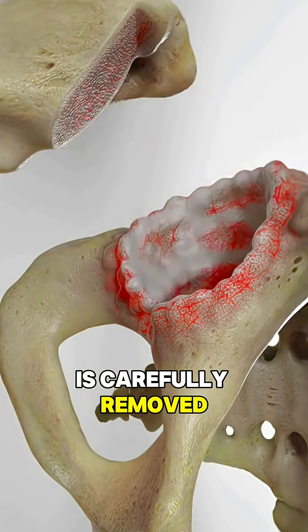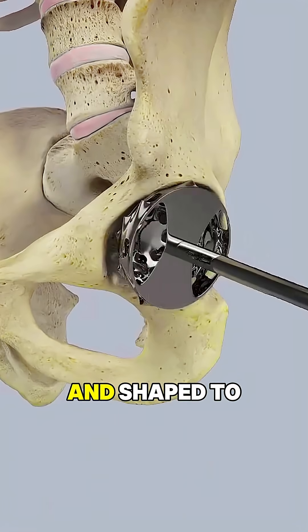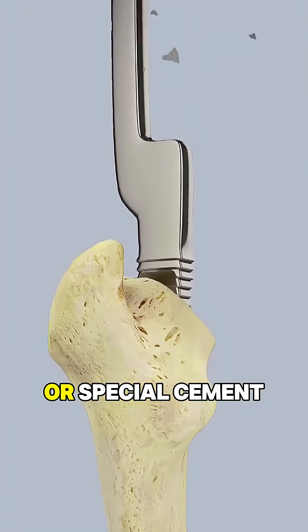Then the hip socket, called the acetabulum, is cleaned out and shaped to fit a new cup. A smooth metal or ceramic cup is placed into the socket and secured, often with screws or special cement.